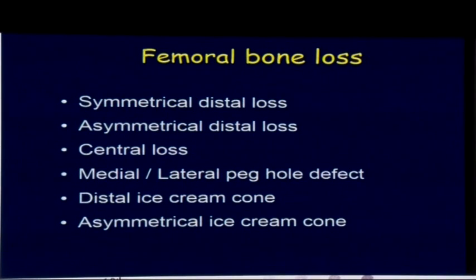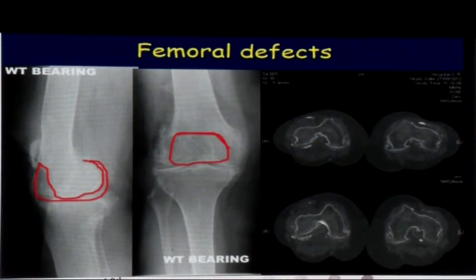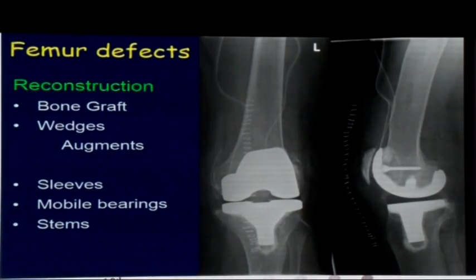This is one that I'd shown you before, where you can see, if you analyze it, the entire lateral femoral condyle is missing. And incidentally, this is bilateral. And I put the CT scans up there for you. The lateral femoral, the anterior compartment, the lateral half is missing. There is no system presently which actually reconstructs the anterior bone loss, and I had to think on my feet as to how I was going to do that. Fortunately, I managed to use the cut bone, fixed it with the screw right at the edge in a position where I could place the implant. And you can see the severe patellofemoral wear. The patella is just a sliver of bone, and fortunately, she's doing reasonably well.